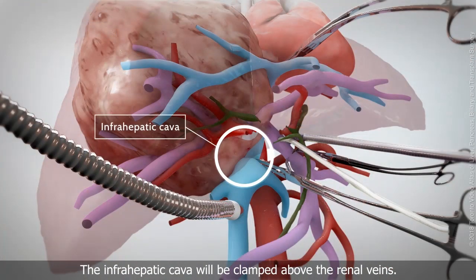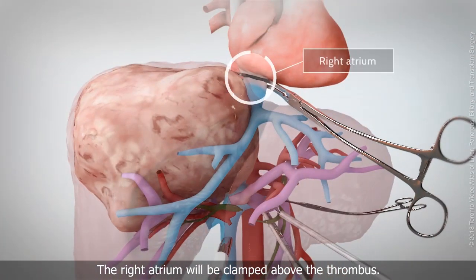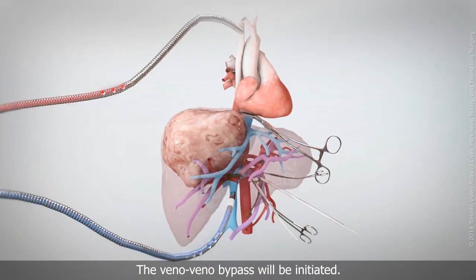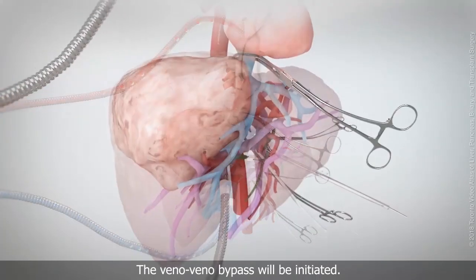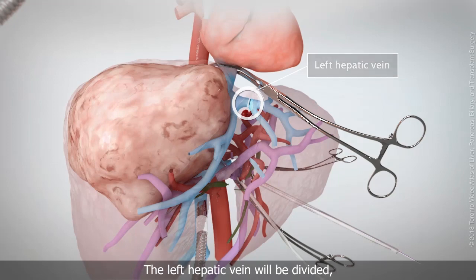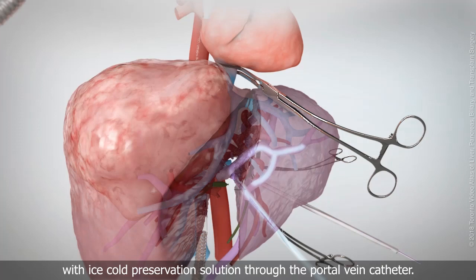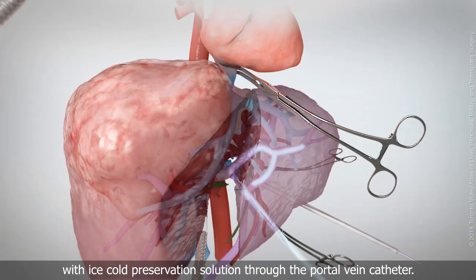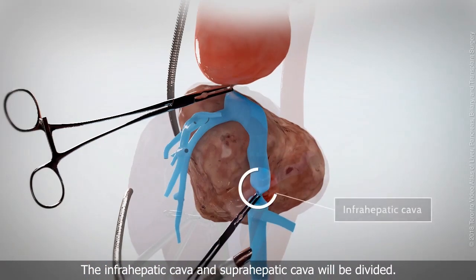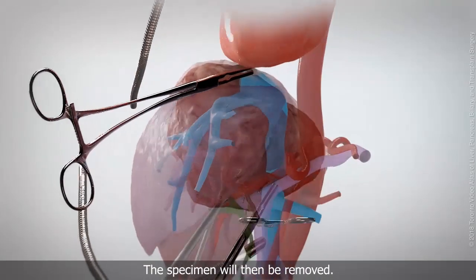The infrahepatic cava will be clamped above the renal veins, and the right atrium will be clamped above the thrombus. The veno-veno bypass will be initiated. The left hepatic vein will be divided, and the remnant liver will be perfused with ice-cold preservation solution through the portal vein catheter. The infrahepatic and suprahepatic cava will be divided, and the specimen will then be removed.